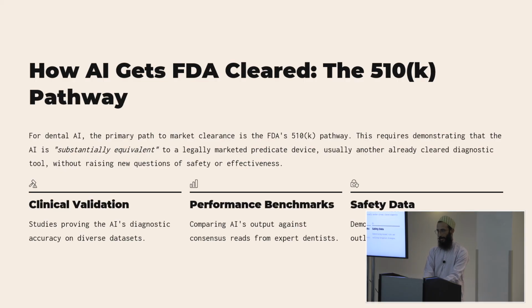For periapical, I don't know what the term periapical radiolucency is what we called it. Yeah, sure. Parl, cool. I'm gonna forget that. Parl, okay. For calculus, there's a separate one. So it was all run under the same full clinical trial when we ran it, but they're evaluated separately.